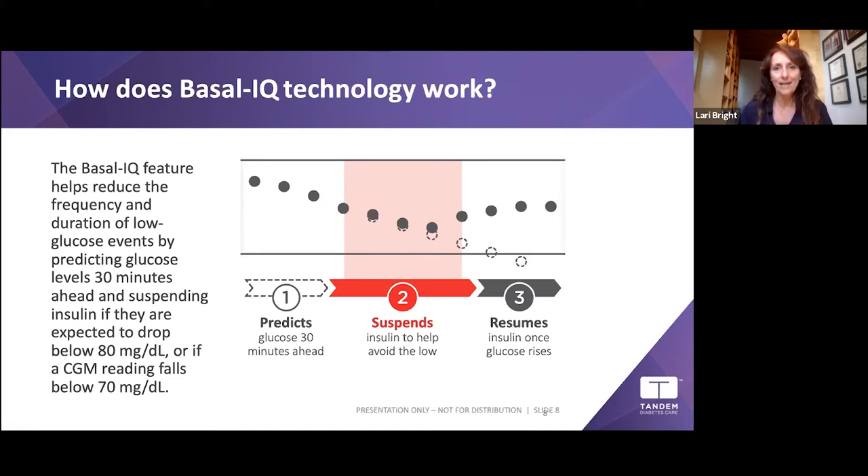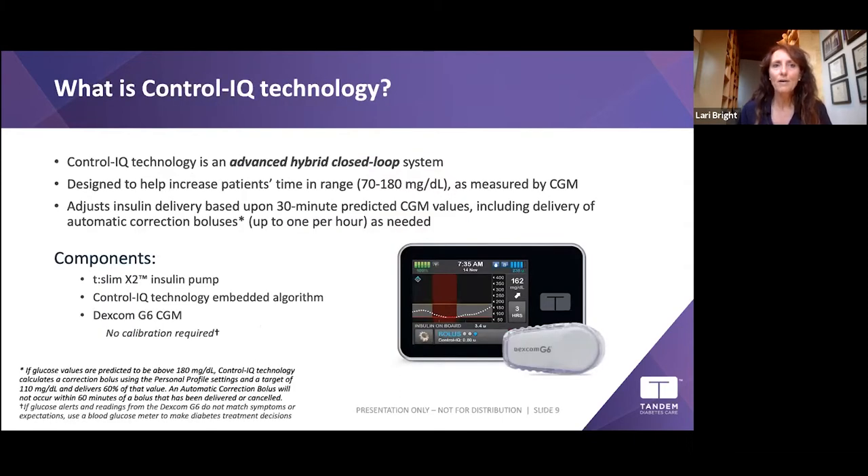Now let's talk about Control-IQ technology. Control-IQ is an advanced hybrid closed-loop system. It's 'advanced' because it not only turns your basal rate up or down, but it will also give you an automatic correction bolus using your pump settings to calculate how much insulin you need to bring you down. It's designed to increase time in range — the ADA guideline target range is 70 to 180 mg/dL, measured by your Dexcom G6.